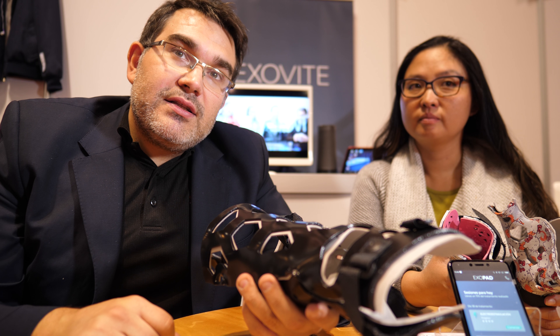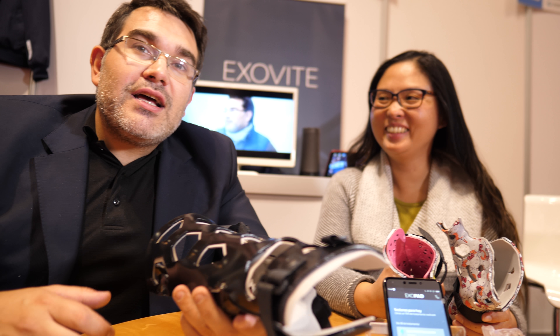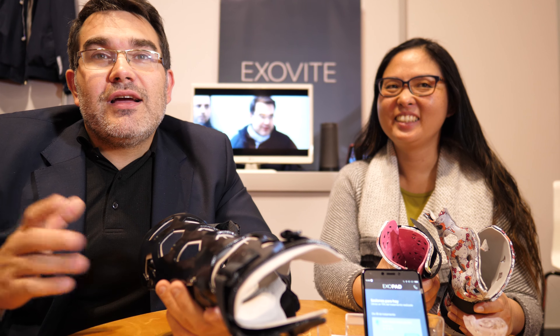Five minutes? Yes. How? Is this magic? What's your 3D printer? It's a kind of 3D printing — actually, it's a digital manufacturing tool. And we can do that that fast because we dedicated the last three years in research about this technology.